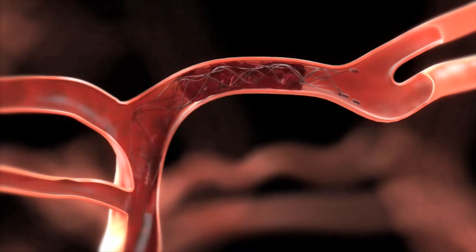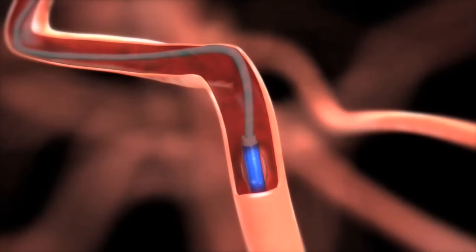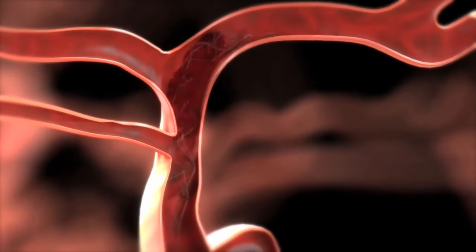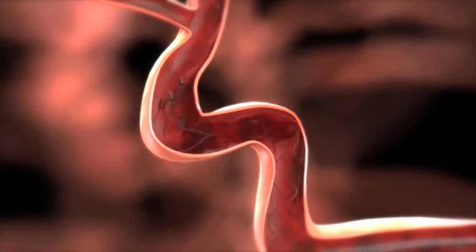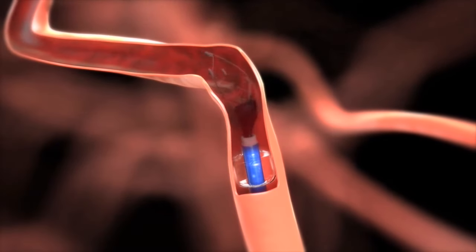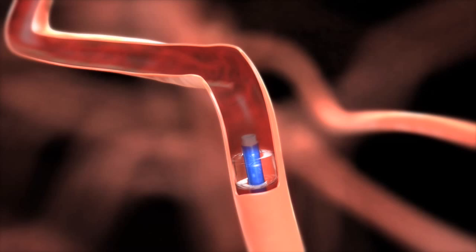we inflate a balloon in the carotid artery in the neck, which arrests flow, and then we pull back the stent retriever device with the clot entangled inside it into that balloon catheter. The purpose of inflating the balloon in the carotid artery in the neck is to reverse flow from the brain arteries and into the catheter out of the patient's body.